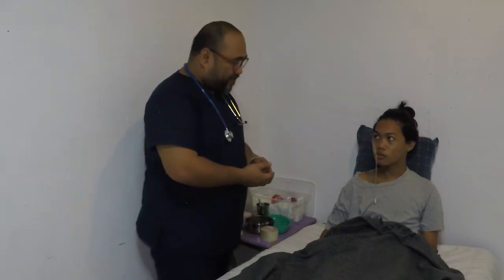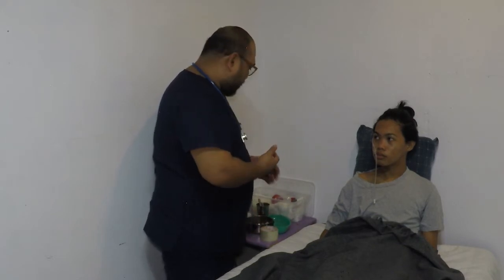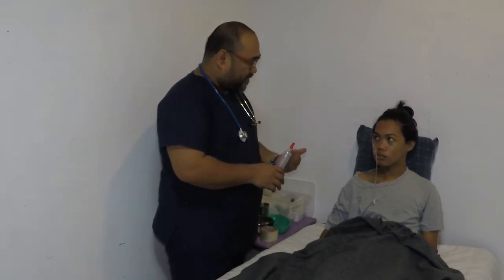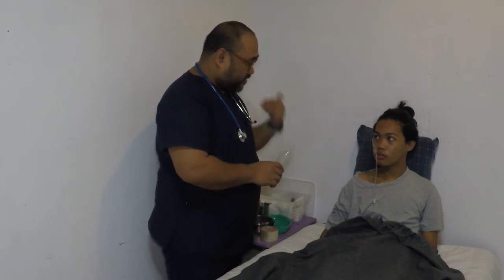We have to explain the procedure to the client. This is to foster the client's cooperation and understanding. Okay, sir, my name is Erich again. We'll be doing the tube feeding now. Since you cannot swallow food in your mouth, we'll be using this to feed you the liquid through your nose. Okay, so your name again is Andrei. We will be continuing the procedure after we did the insertion of the tube.